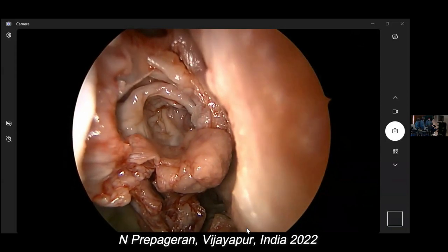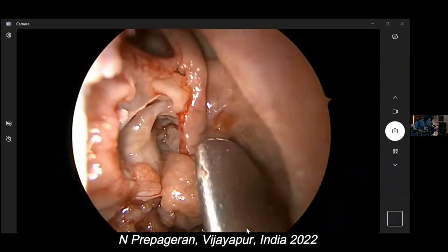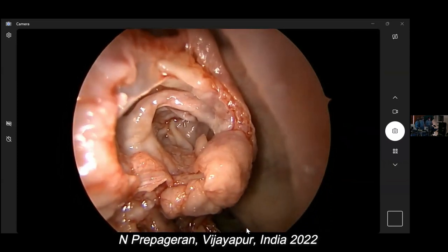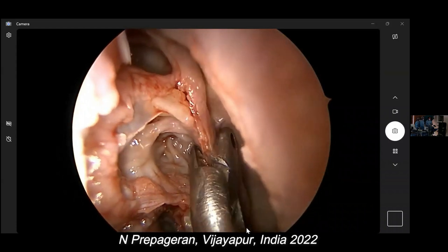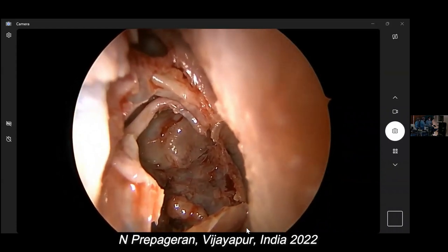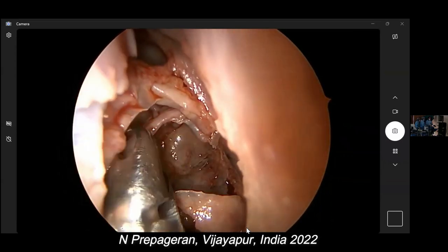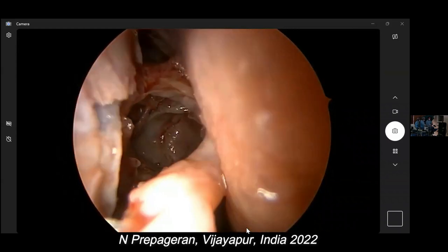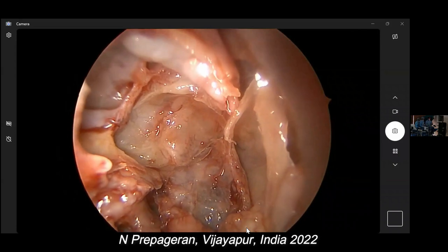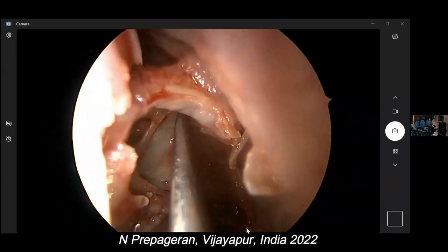Gate number three would be the ground lamella, correct? You see where it's turning? Because of the dissection now, I'm going to remove the mucosa so that you can see it much clearer. That's the mucosa that I'm removing, which we will not do in real life. For dissection, we're going to remove it so that you can see much clearer. Once we have removed the mucosa, can you see gate number three? Very clearly seen.